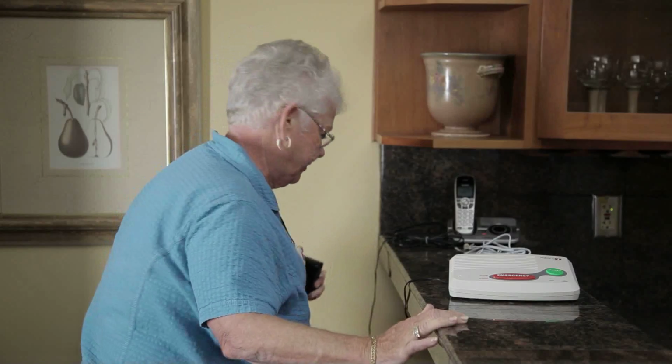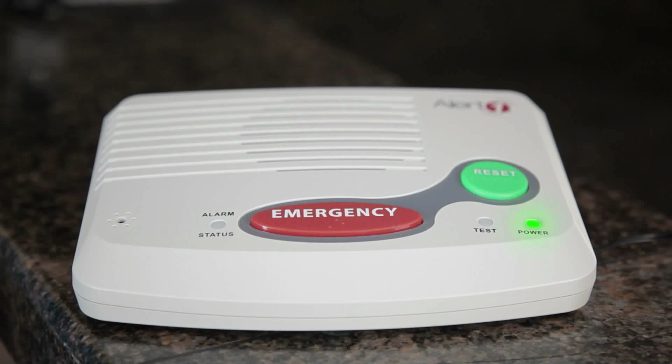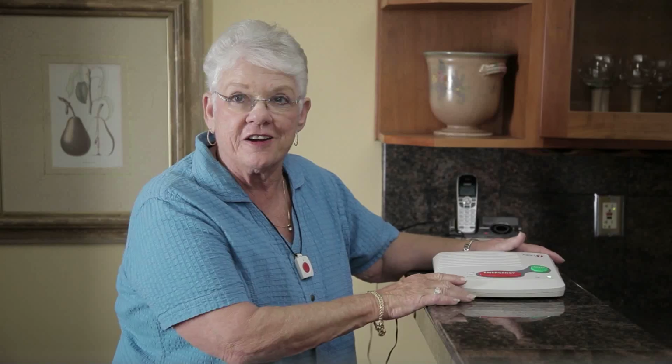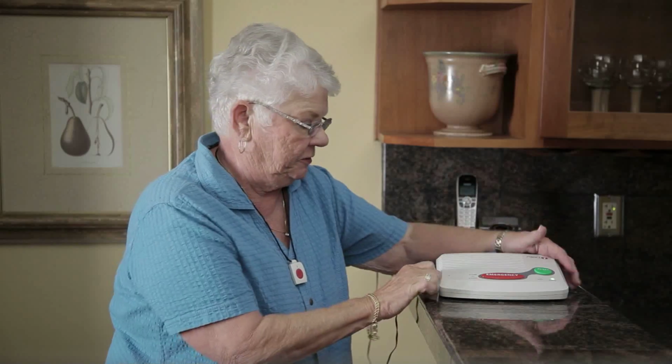First I plug it in. The green power light is on. So far, so good. Insert the included phone cord into the outlet on the back of the unit.